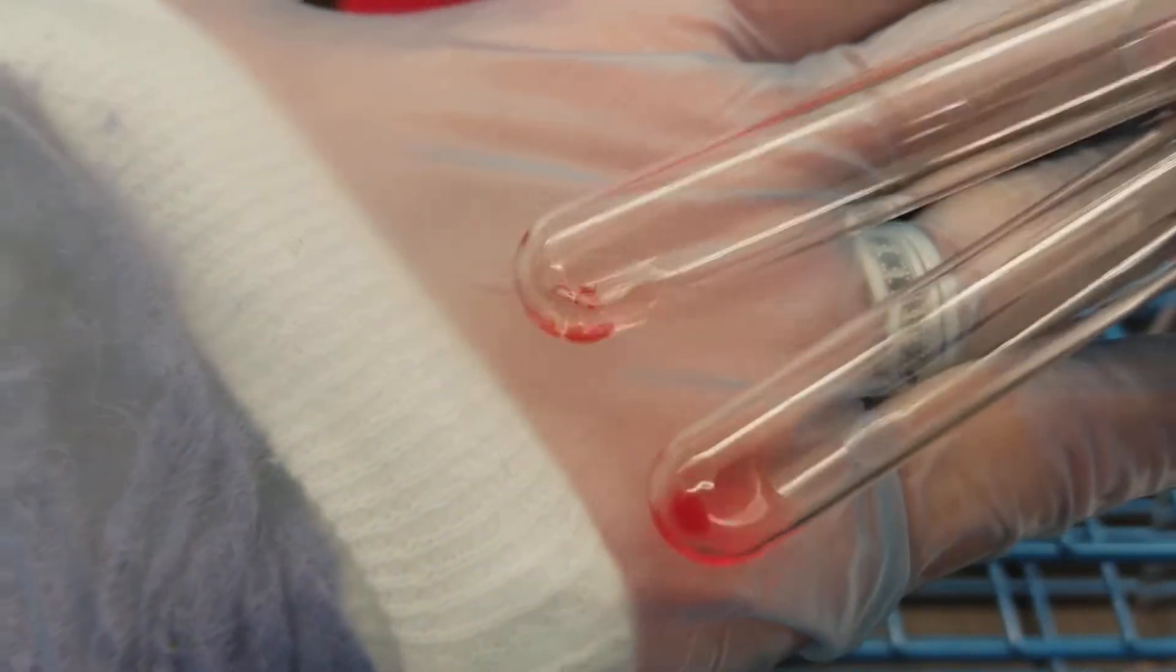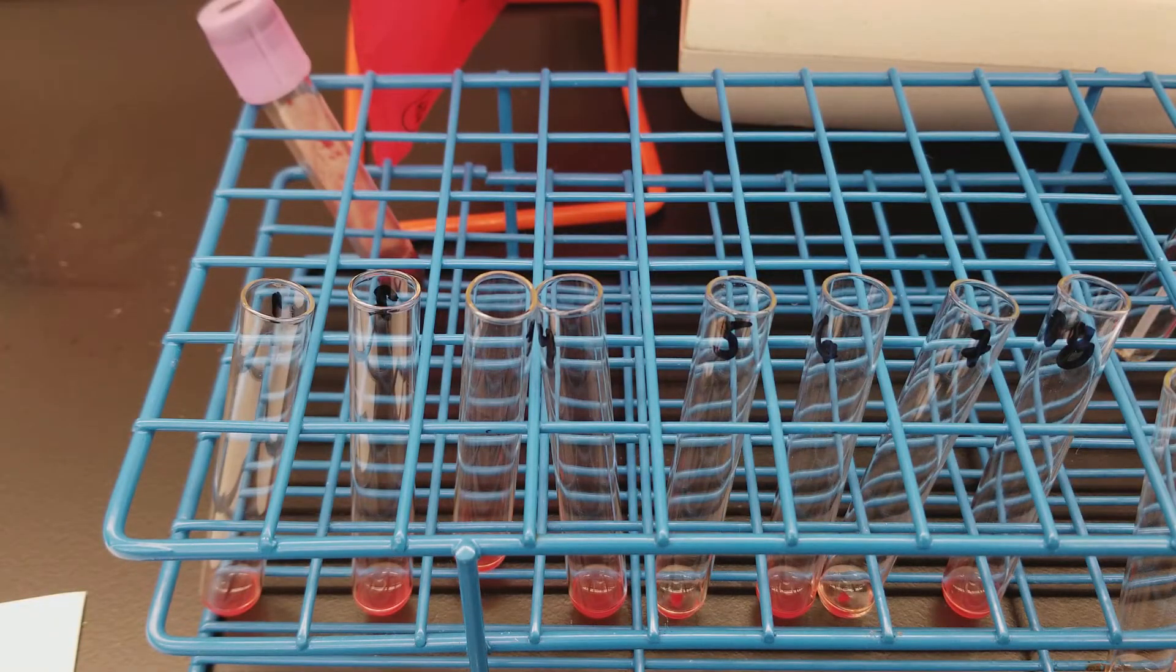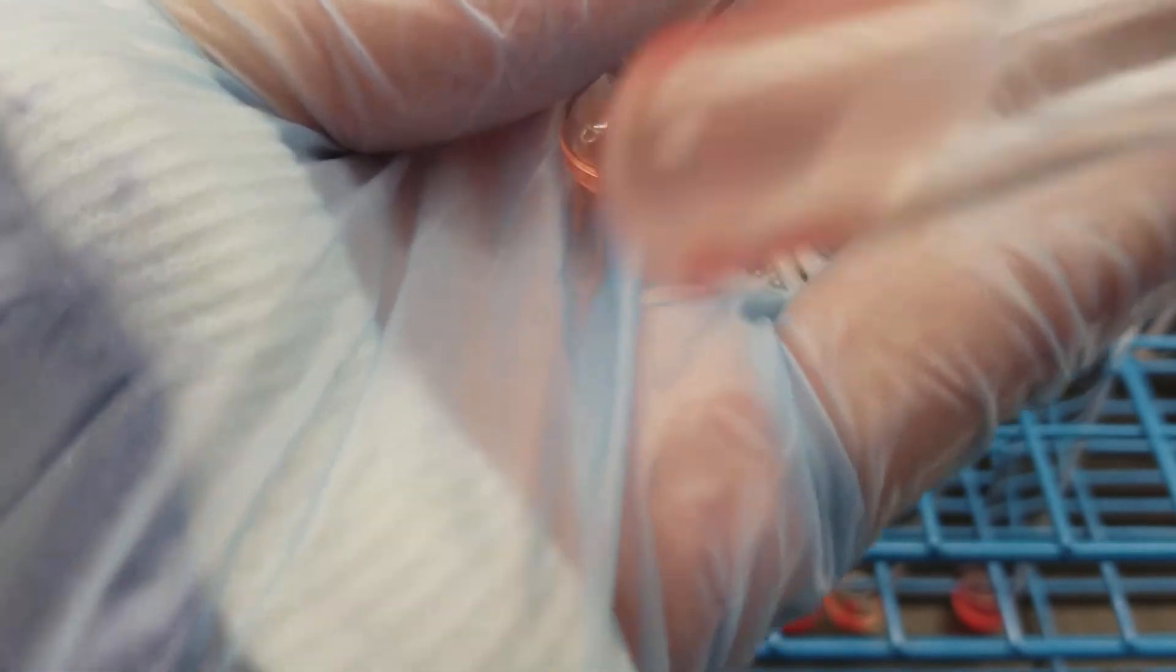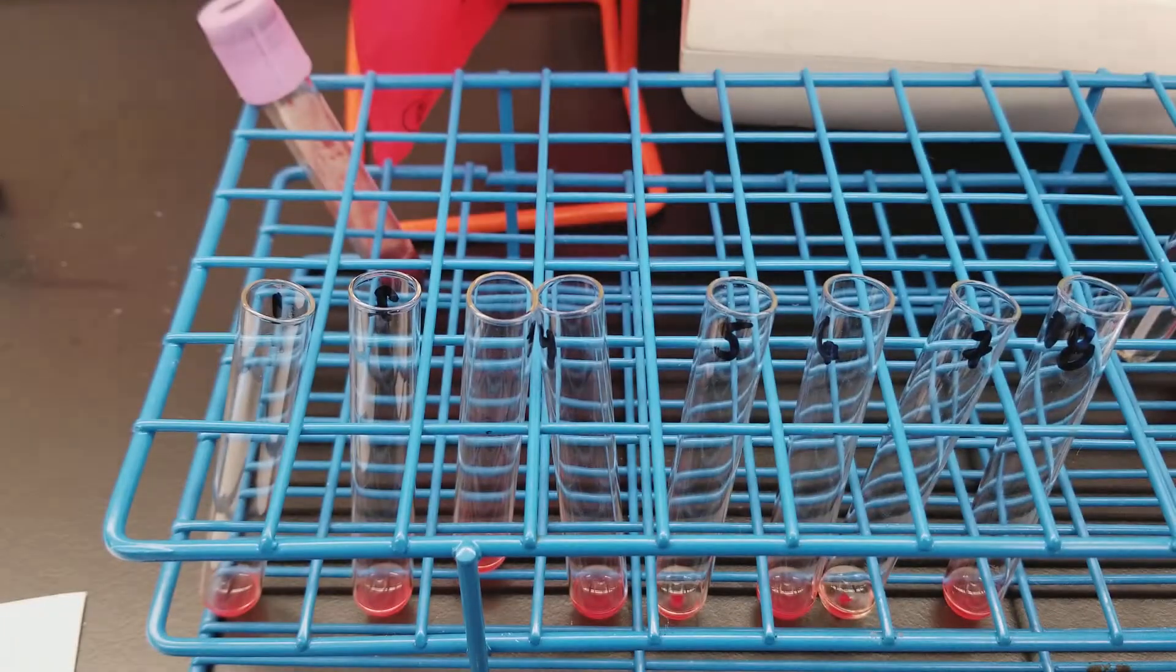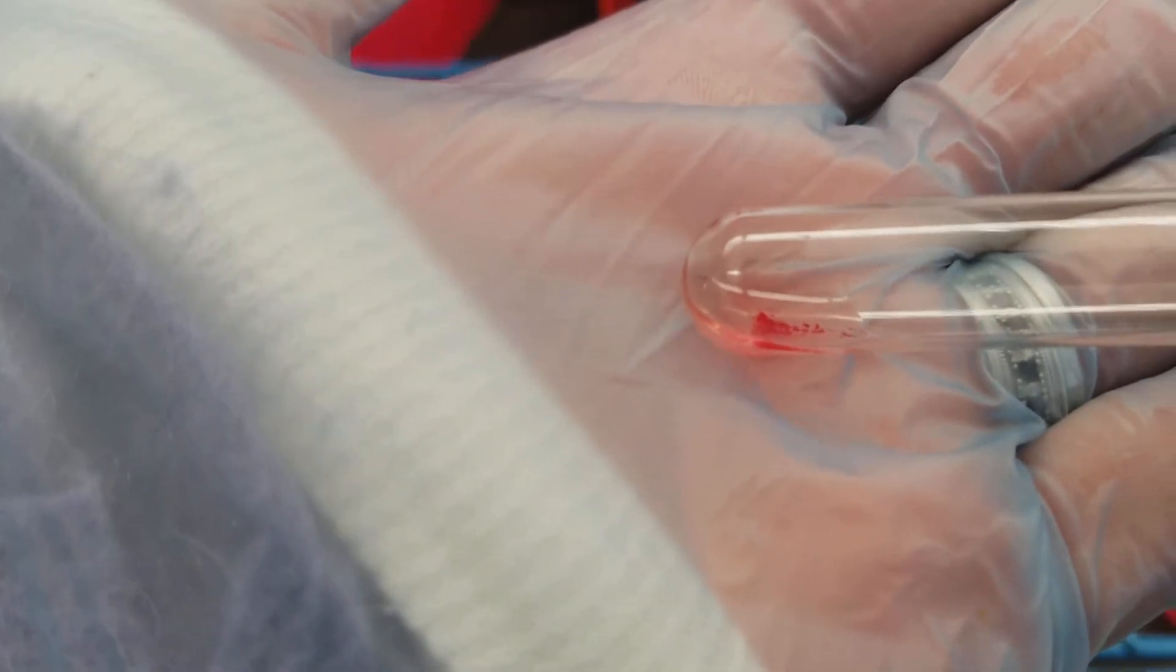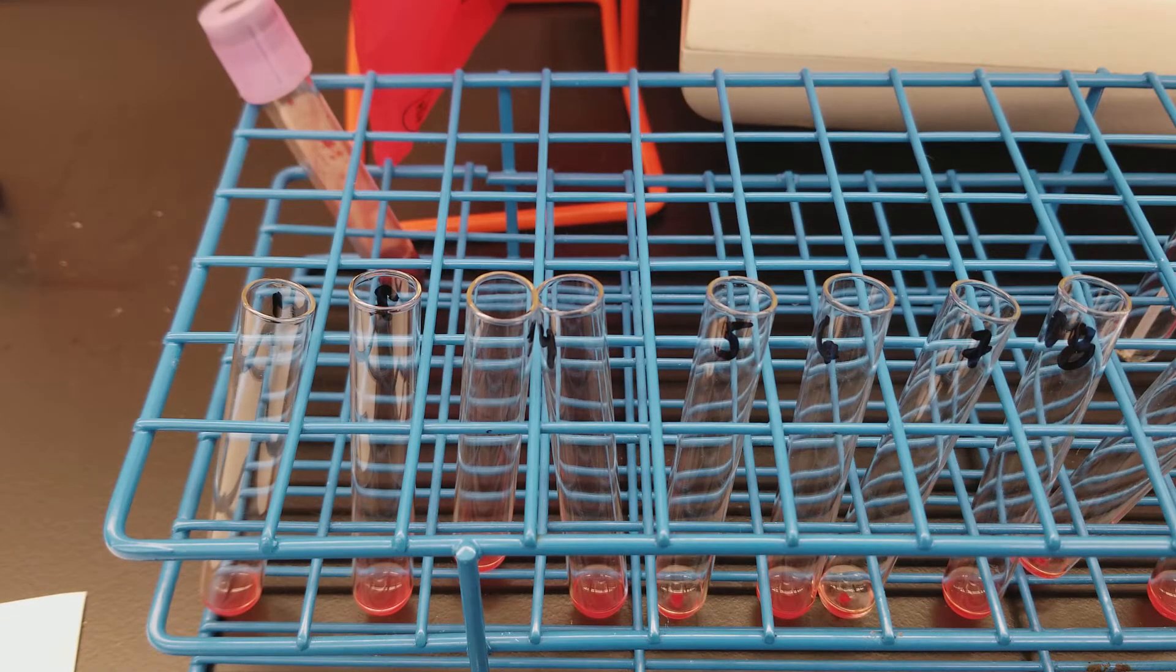Seven. Oh, seven is positive too. We're going to say that's a three plus as well. Eight's a negative. Three plus, a negative. Nine and ten. Oh, we're having some positives here. Ten is negative. I think. Yeah. Ten is negative and nine is another three plus. Some big agglutinates in there. So three plus, then negative.